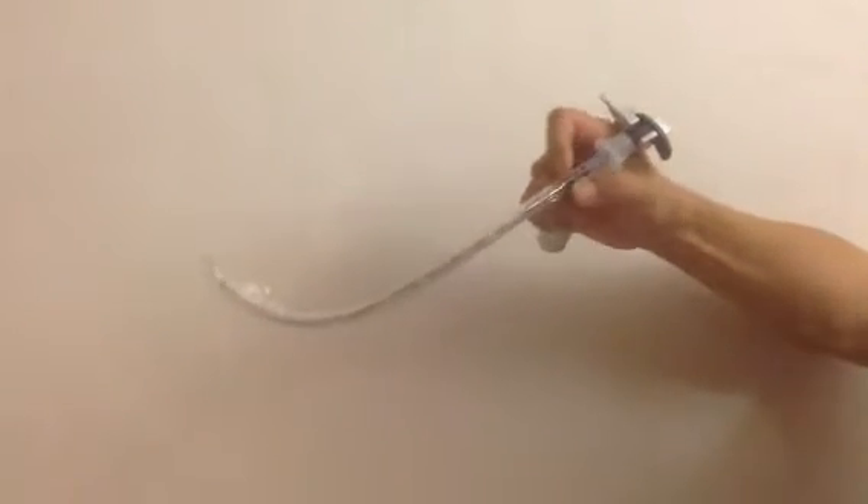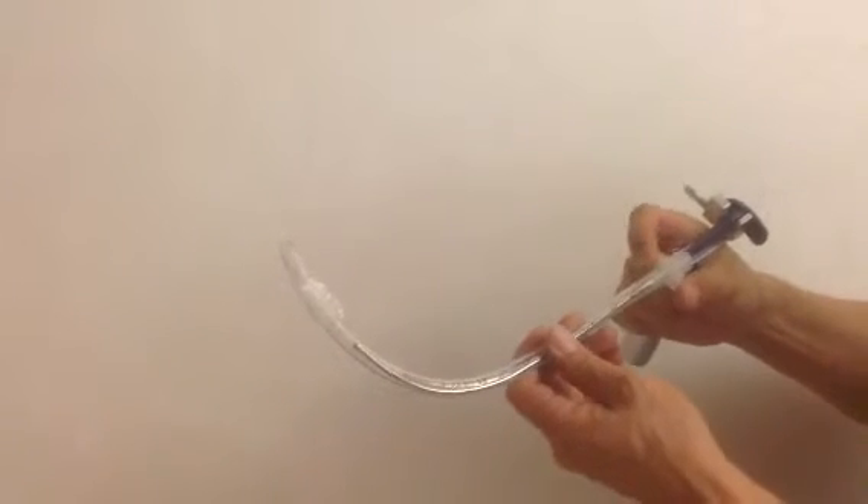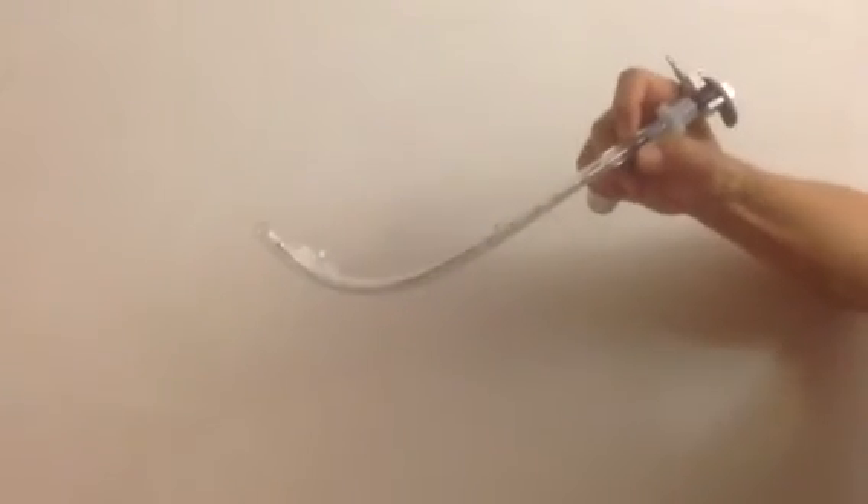Or you can push the ET tube with the thumb and the index finger like this. So you can push with the index finger and thumb like this.